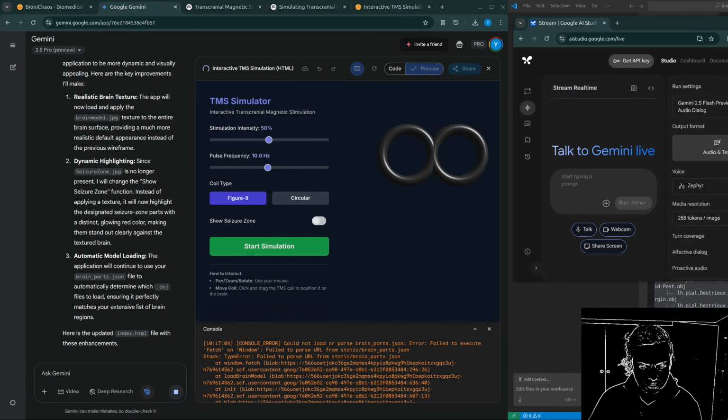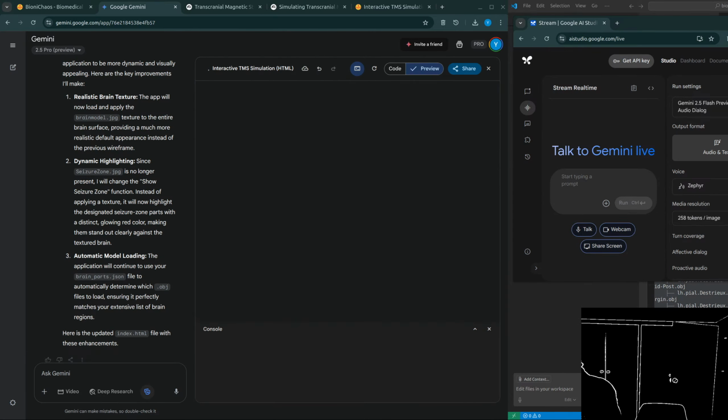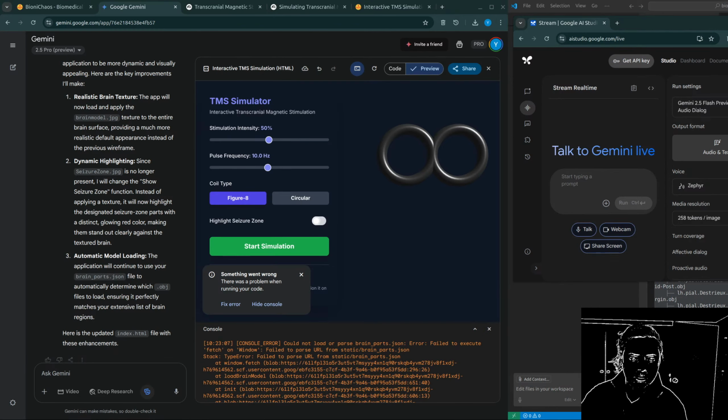We've built this incredibly detailed digital twin of an individual's head, mapped out all the tissues, their electrical properties, broken it down into a mesh for computation. What comes next? Okay, so now we need to introduce the source of the stimulation itself. Stage 2 is all about modeling the TMS coil and then, crucially, calculating the electric field it induces within that realistic head model we just built.